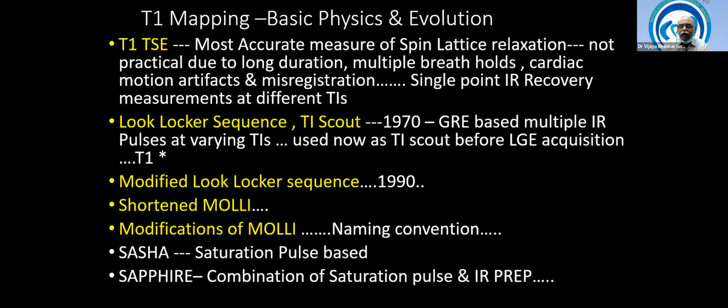So based upon that, quantifying the segments of the LV epicardium and myocardium is very difficult. There are a lot of artifacts. So the sequence has been modified from what is known as the Look-Locker sequence, giving the modified Look-Locker inversion recovery sequence (MOLLI). That was promoted in 1990.